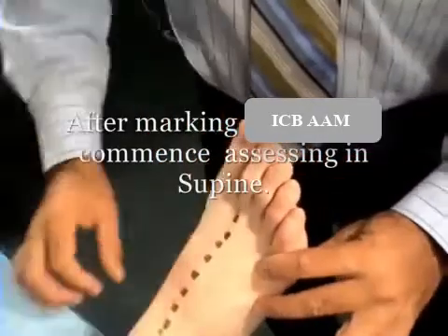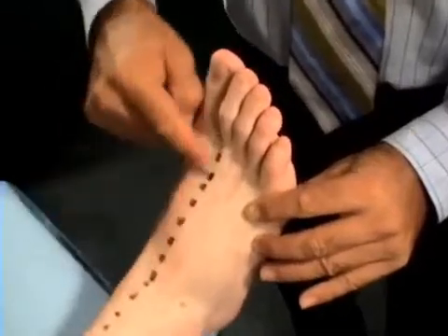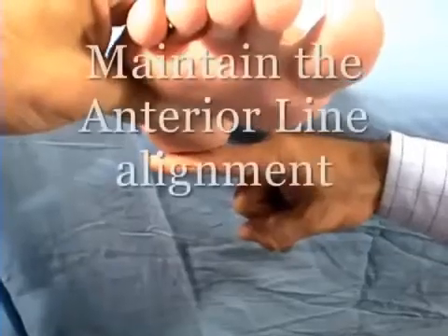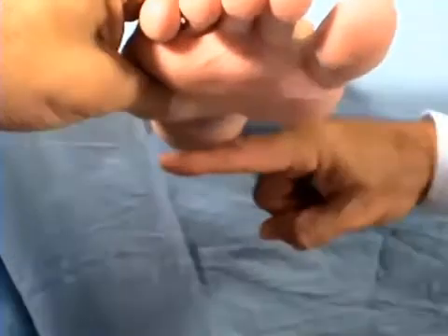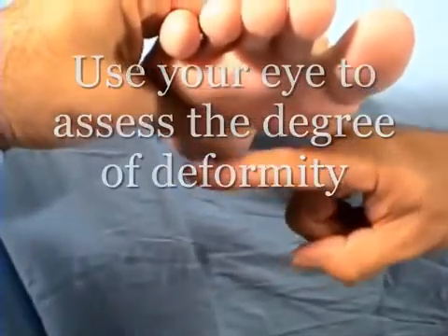In the supine position, use the line to check forefoot valgus and forefoot varus. Hand position is very important to allow the assessment to flow. Maintain the anterior line while assessing both forefoot and rear foot planes for forefoot varus and valgus deformity.